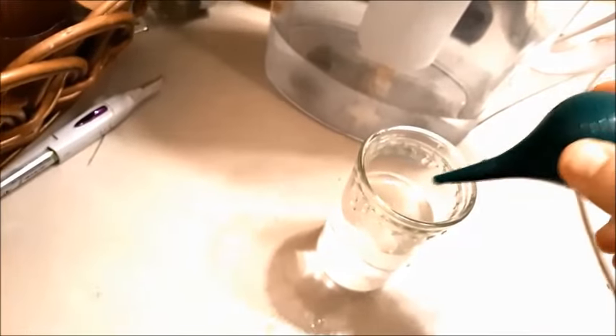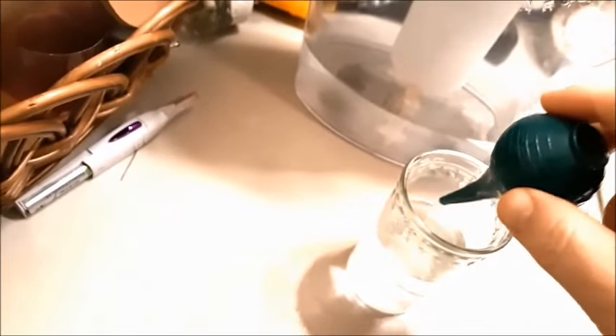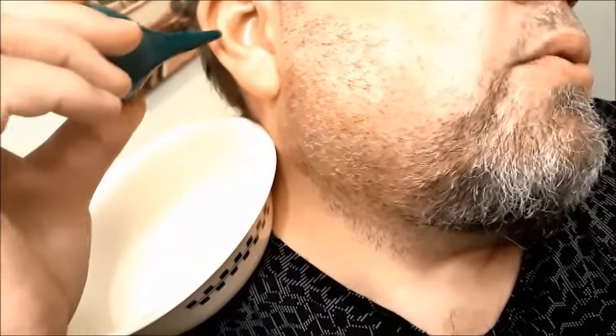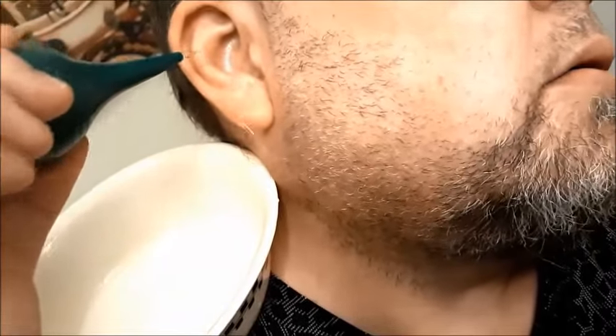This time I'm going to put a little bowl on my shoulder and we're going to spray. If you can get someone to help you out that would be good, but it's not necessary. Now we're just going to spray with force the hydrogen peroxide and water solution. I've got water on me, but that's okay. That's going to marinate and spread — you might want to try this four or five times. Do this a couple of times each day and hopefully it will remove the earwax.